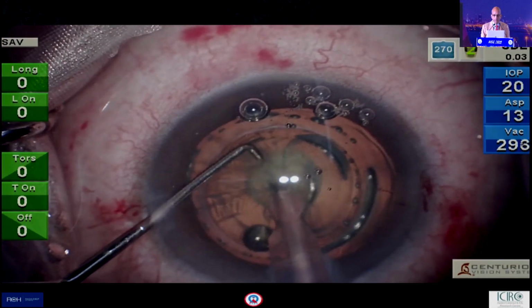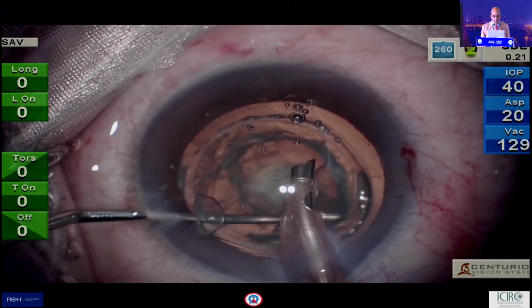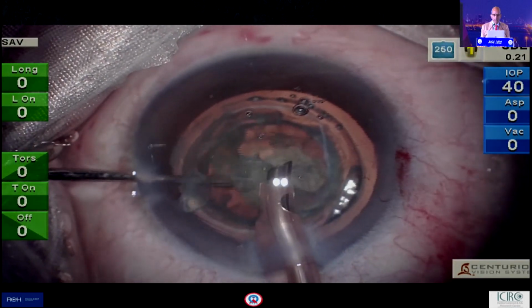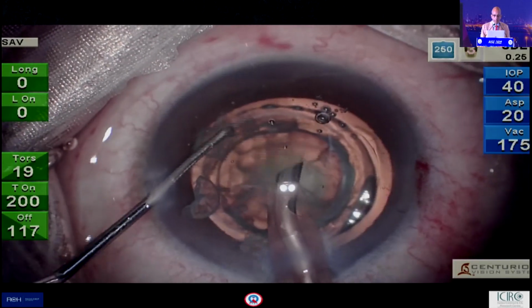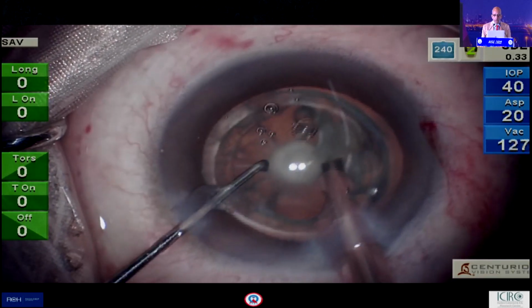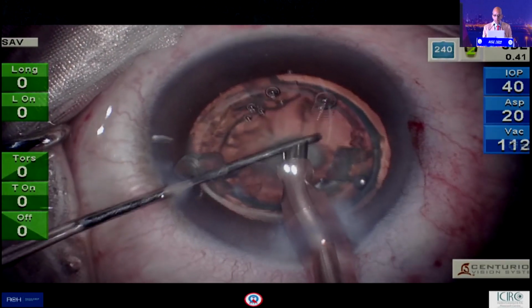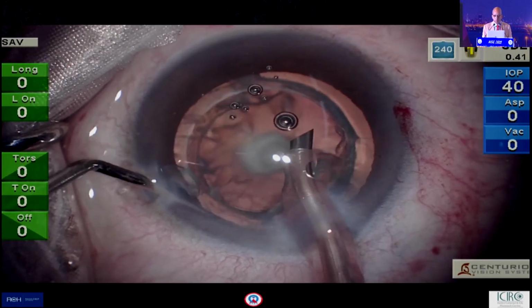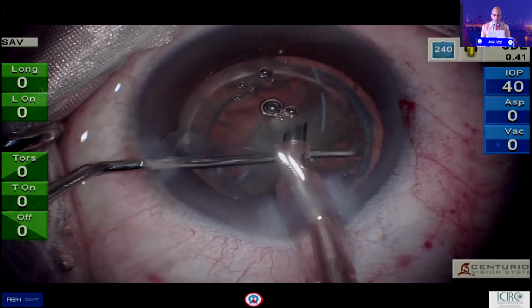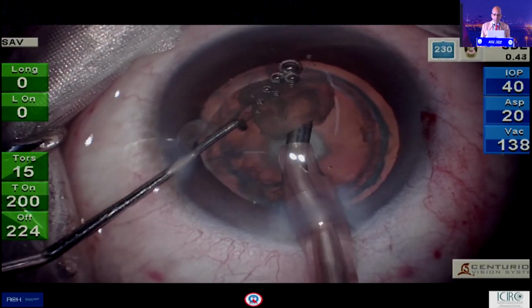So there is Professor Titiyal's presentation here with Manpreet, but this is what we typically do. I don't want to go into details, but you can shell out these femto-demarcated fragments to the tip, and that makes it very easy and user-friendly. I'm not able to move this forward for some reason, that's okay. And then when it comes to the subincisional, the same procedure, shelling out, and it is so easy because it's laser cut, a very sharp division, and it's very easy without rotation.